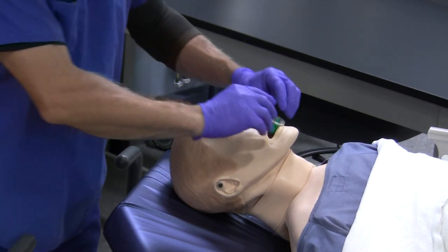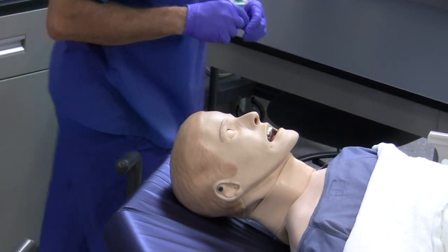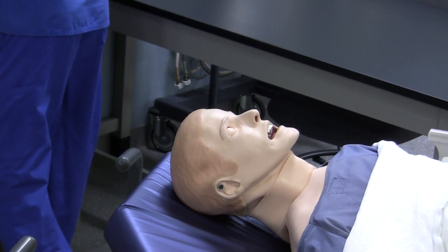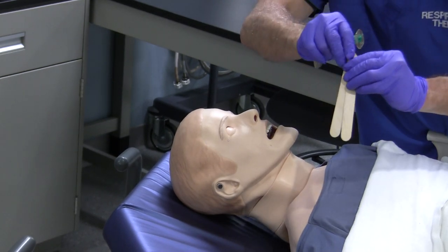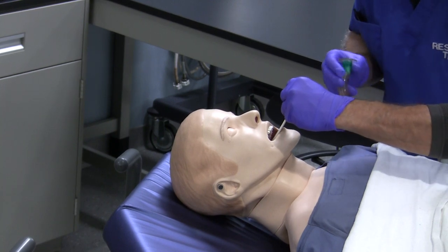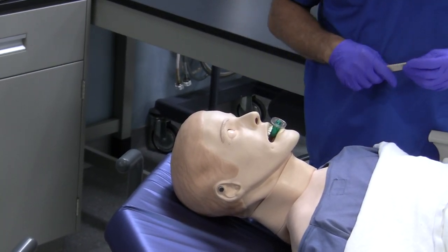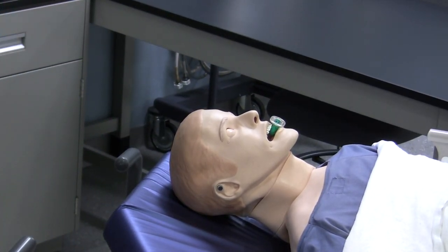A third method is to use tongue depressors. Facing the patient, place one or more tongue depressors into the patient's mouth, pushing the tongue down, and then simply insert the oropharyngeal airway beyond the patient's tongue in that fashion.